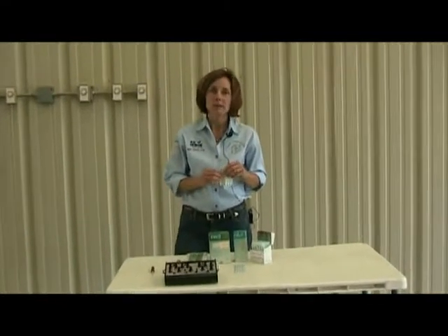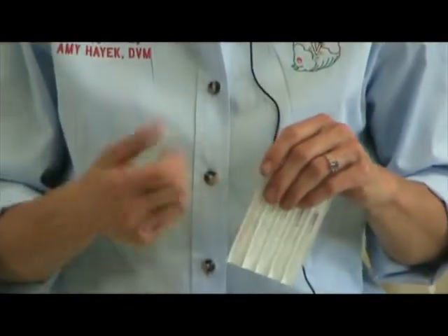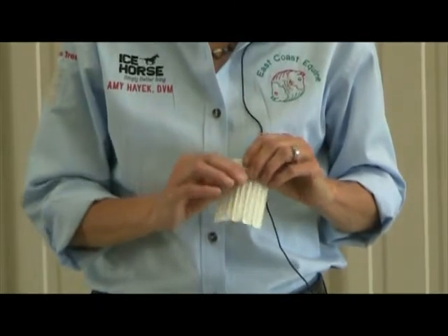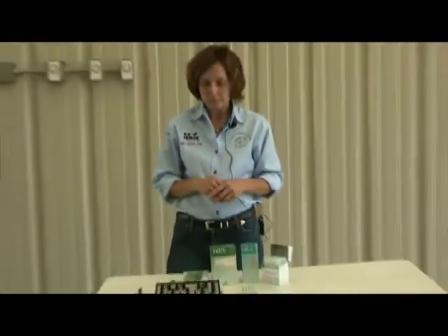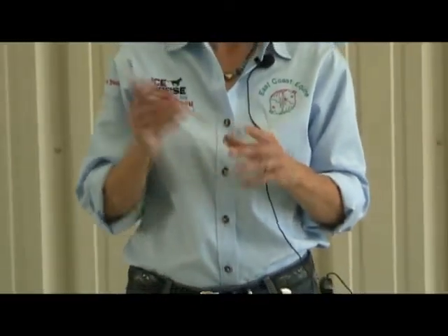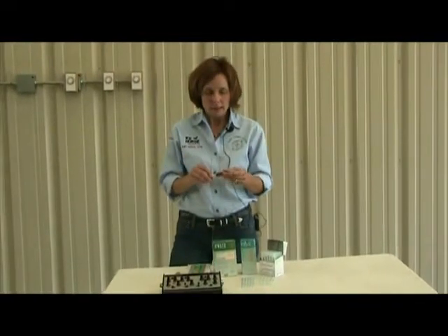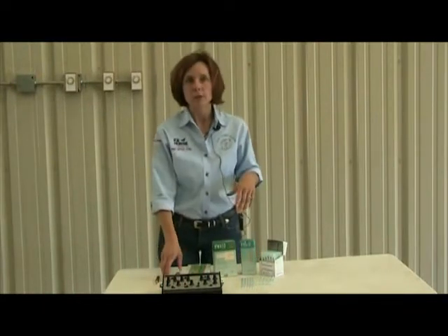In ancient times, acupuncturists had to make their own needles and would oftentimes make them of wood or of steel, and sometimes those needles would have to be very, very long. So we have individual one-time use needles that are used in different lengths for different applications. We also oftentimes will use what's known as aqua acupuncture, where we take a needle and a syringe and actually inject a liquid into the acupuncture point to keep the stimulation in that point going for a much longer period of time. Sometimes we use saline, sometimes we use blood of the animal to help stimulate their immune system.